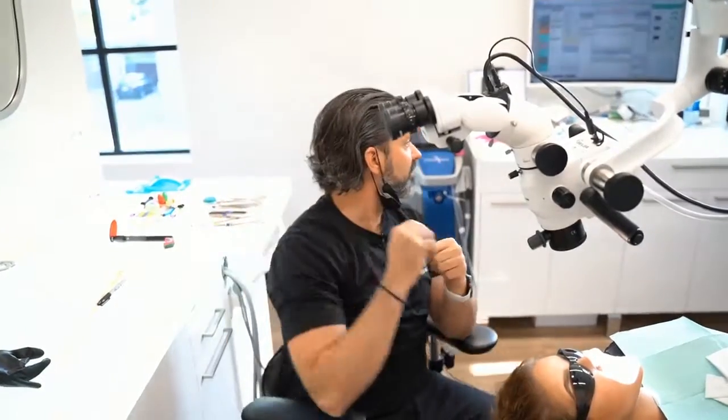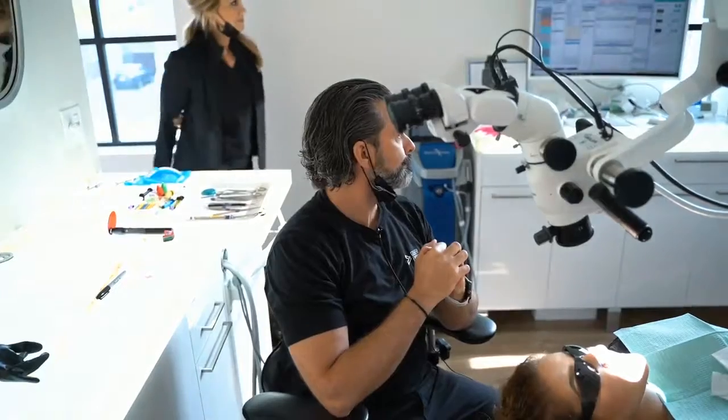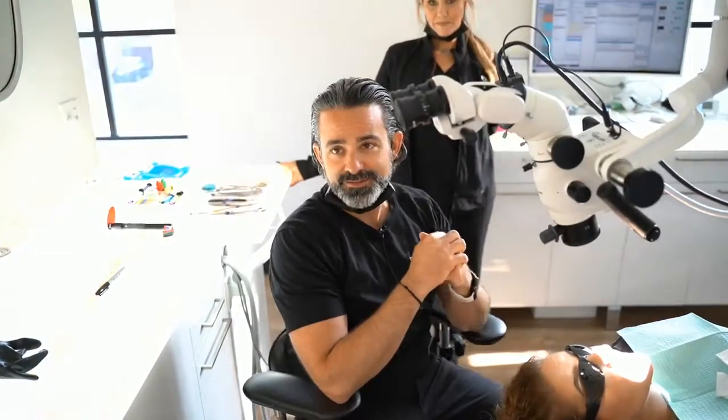Vicki, will you turn off those overhead lights? Let's see. Yes, thank you. She was Brandon. Let me see. I pieced it upside down. Okay, Florina. Let's see.